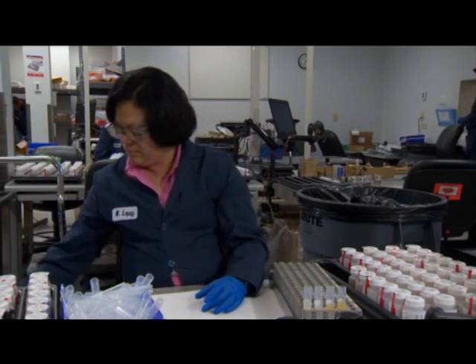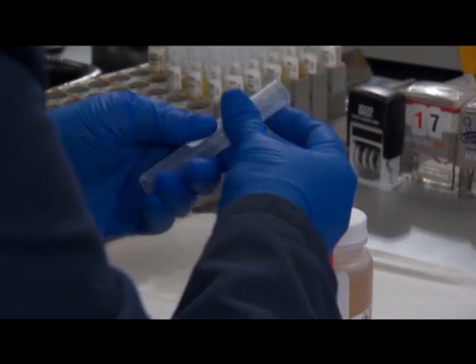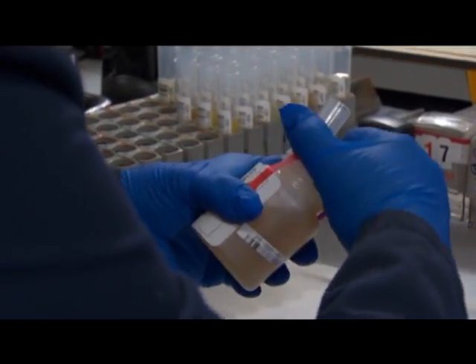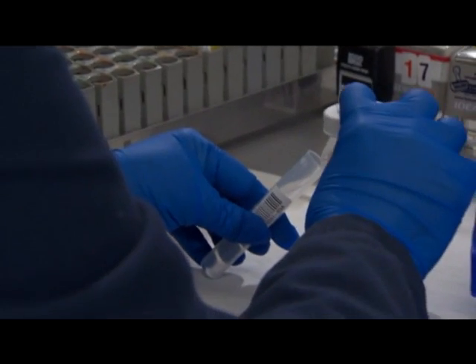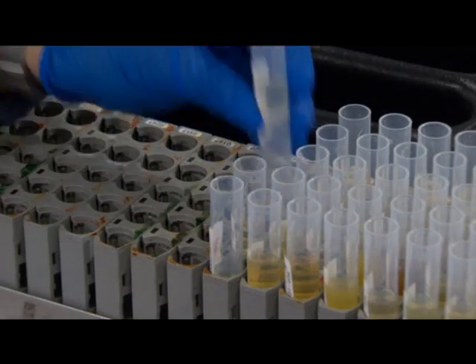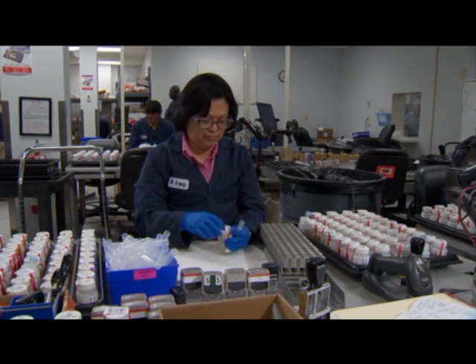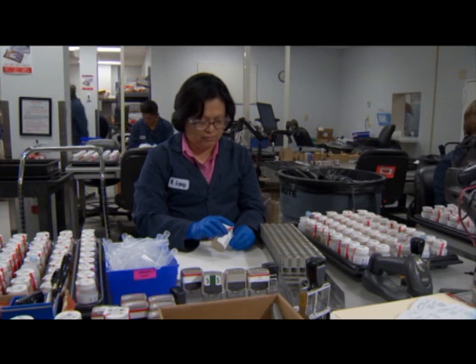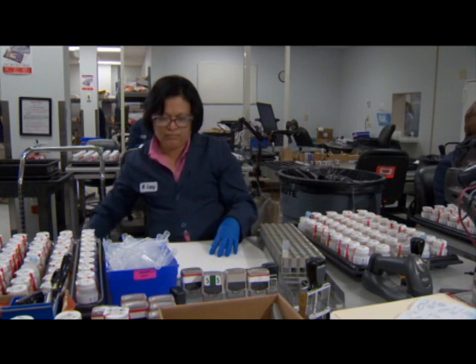Once batches of specimens and blind quality controls are assembled, the Accessioning division technician, handling one bottle at a time, breaks the bottle seal and pours a small portion of the specimen into a test tube labeled with the LAN identifier. This test-ready portion is called an aliquot. To avoid contaminating the specimen, nothing is ever inserted into any bottle, and only one bottle is opened at a time to avoid any confusion.